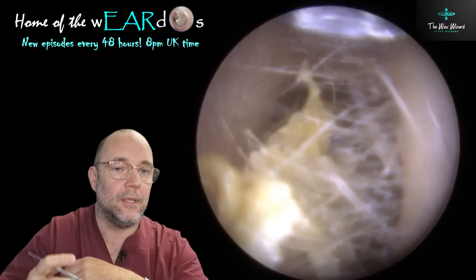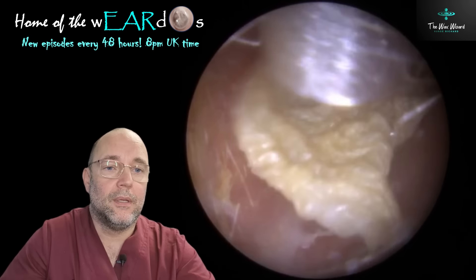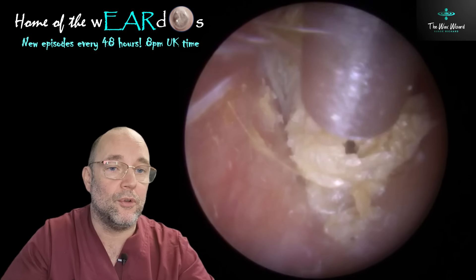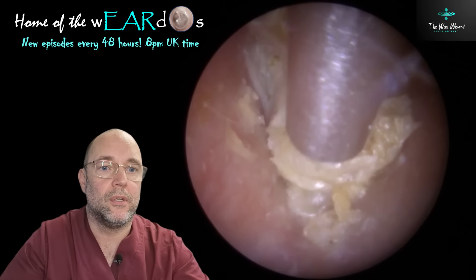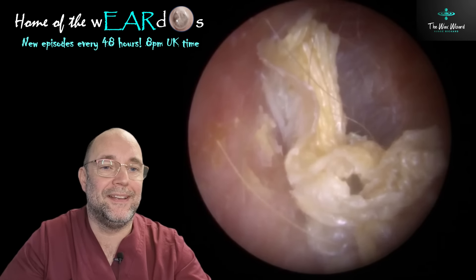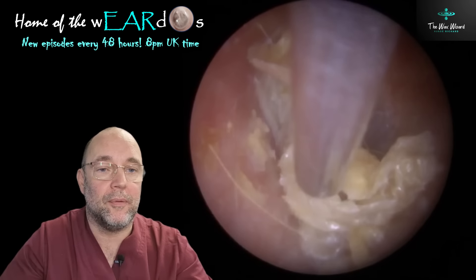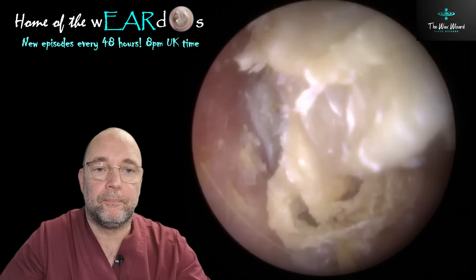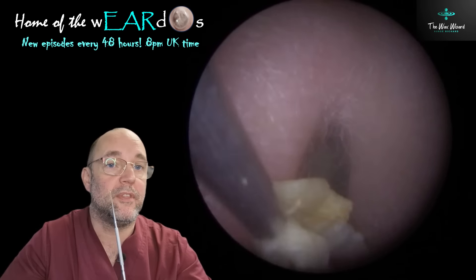I couldn't really drag it forward because it's not sharp enough to dig into it like the Rosen inserter is. I found it a bit easier to use than the Rosen inserter because it's quite an elongated bend. I suppose the Cawthorn hook would have been good — I did actually get one of those which are a bit more right-angle and a bit thinner with a sharper edge, but I threw it away by accident. Some of the tools we use that look black — like carbon fibre plastic material — are single use, but these ones are stainless steel so you can sterilize them, wash them, and use them again — better for the environment as well.